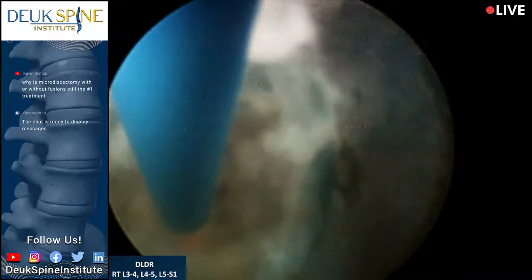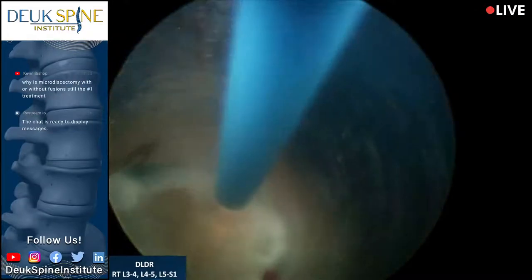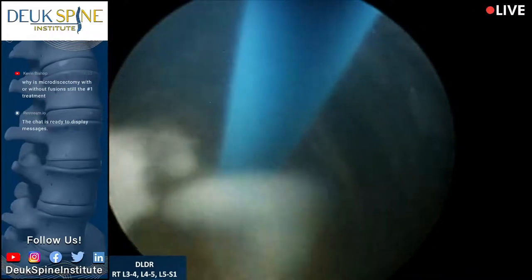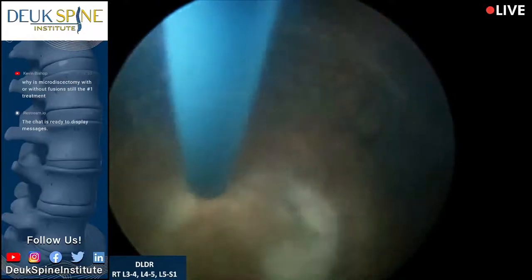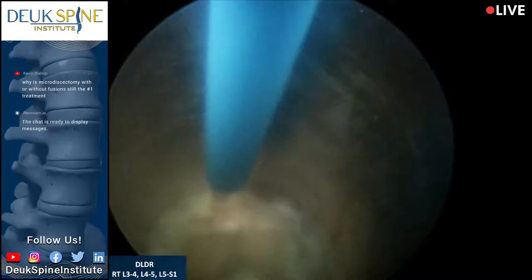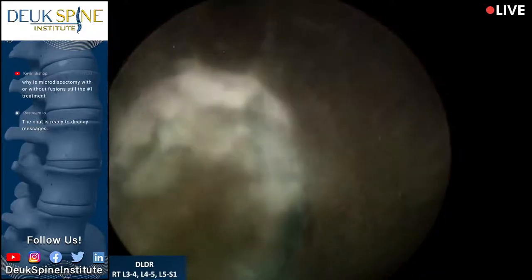And if we did hit those veins, those are small veins, they're not a problem. They're not major veins that the patient needs. You'll find that the laser itself will actually coagulate them. Watch my face, please. Coagulation means to close them off so they don't bleed.